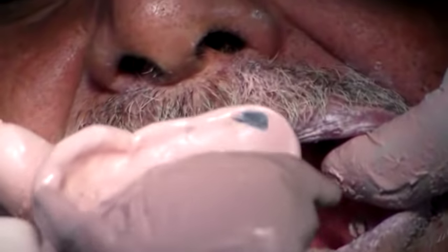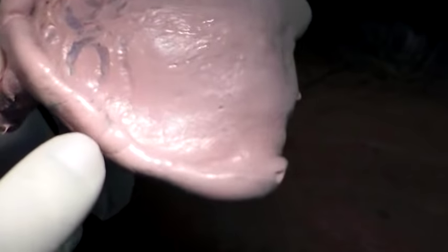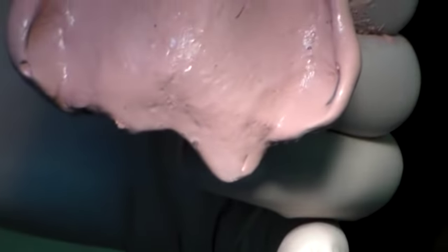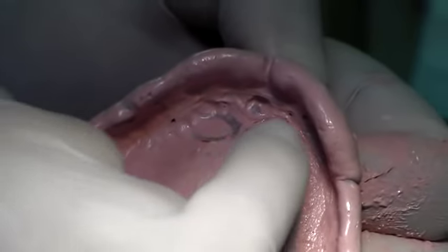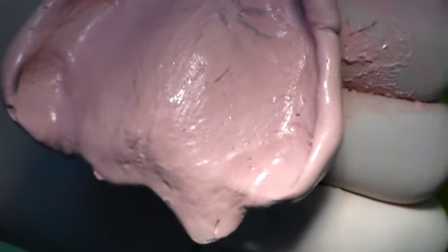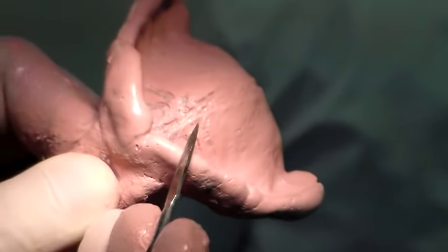I can take off the impression. When I see the impression, very clearly I can see green areas along the border. This shows me that my impression is at the level of the green stick and not beyond it. If you have zinc oxide eugenol sticking up one to two millimeters above the green stick, you know that you have overextended your denture. You may have some denuded areas in the ruga area and the papilla area, meaning they have been compressed. Since this is a close-fit technique, there will be some compression.